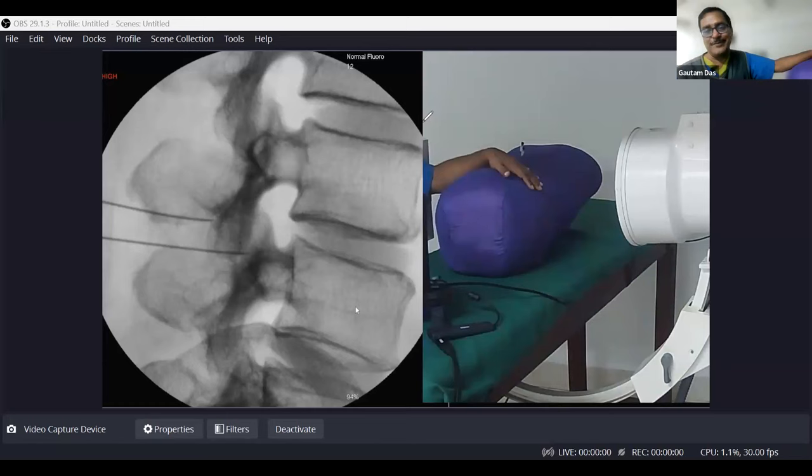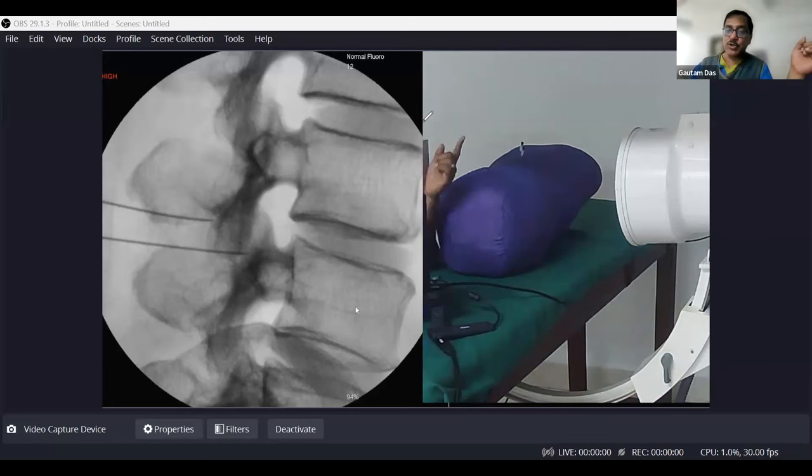But there is one exception, when you are doing endoscopic discectomy, though it is in the advanced class. Then you turn the patient. Suppose the patient is on the right side, then you turn the patient's right side towards you. The C-arm you need not change, it will be opposite to the table. But you just change your patient's head side so that the right side of the patient comes towards you. For all other interventional procedures, your C-arm should be opposite to you across the table, on the other side of the table. And you should do both right-sided and left-sided procedures standing opposite to the C-arm. You should never stand on the same side as the C-arm. Is it clear to everybody?